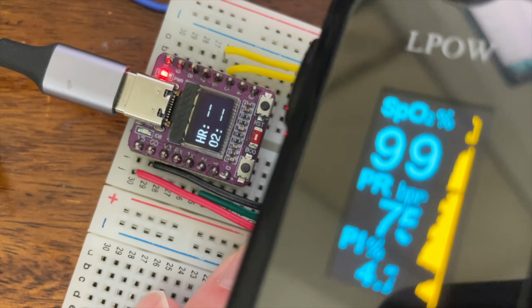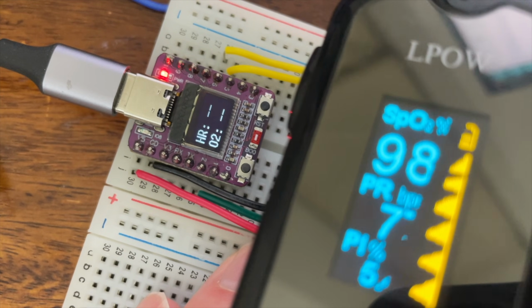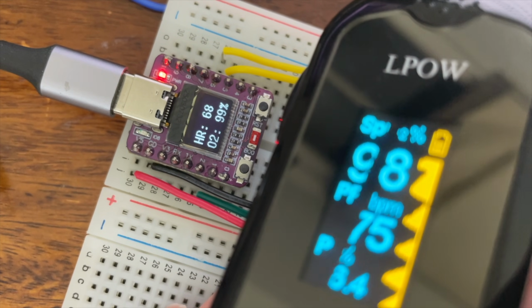It's quite hard to get your finger on accurately without squishing it on. Let's see if we can recapture it. Had it just then. It was perfect. There we go. So it's not bad. Seems to work. Works quite nicely.